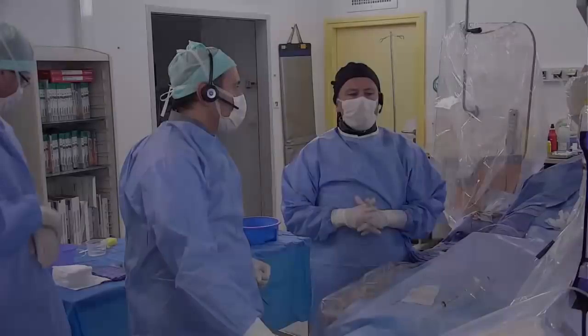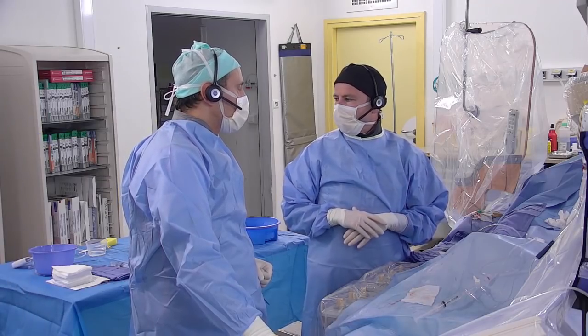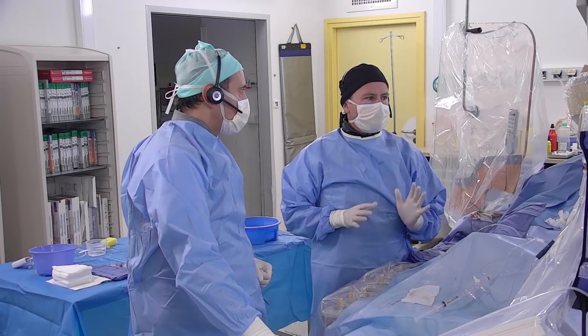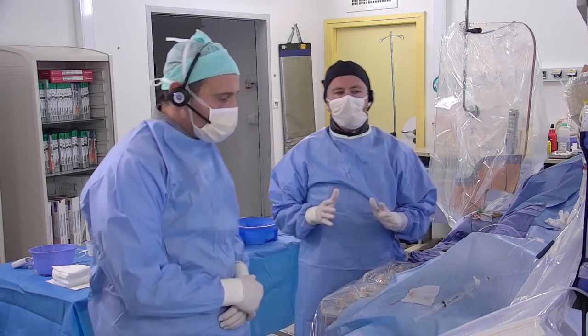For the layman, we can discuss using a larger burr, but I think to start it will be good. You know that there is a long lesion, so we need time to cross the lesion. So we have to prepare it.